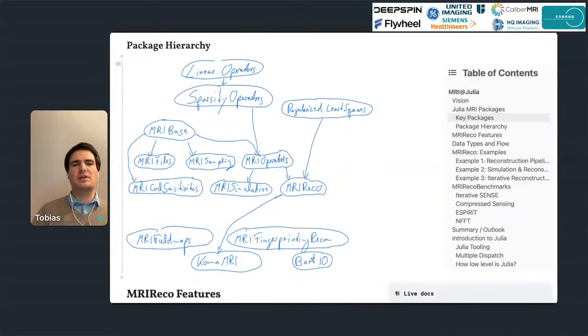And this also outlines quite nicely that it depends on yourself where you want to start. So I like the example that we have seen before by Jeff, where you have seen that the operator itself was built up step by step, and then we just put it into an iterative solver. And I think if you are a developer of reconstruction software, this is the correct interface. So this is what you want.